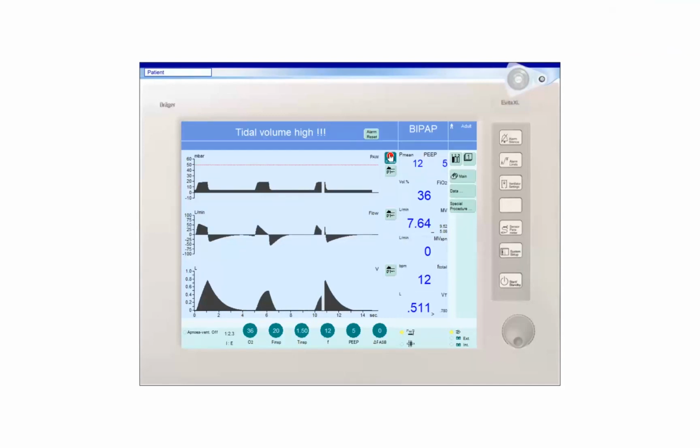Okay, because we are in the pressure control, so the pressure is the same. But in the second wave, in the flow time, the second one, the expiratory flow is shorter. The peak expiratory flow is shorter than the first one. And even the volume time in the third wave becomes less, which is going with the compliance rather than resistance. Excellent.